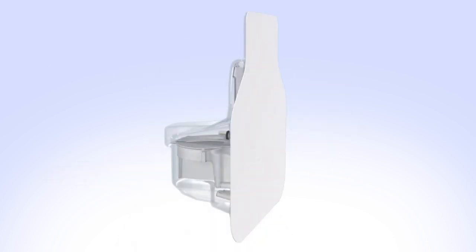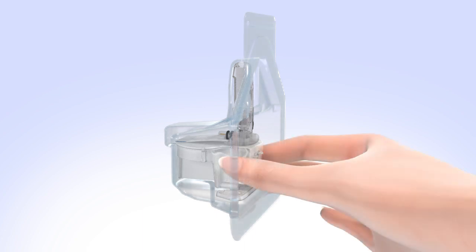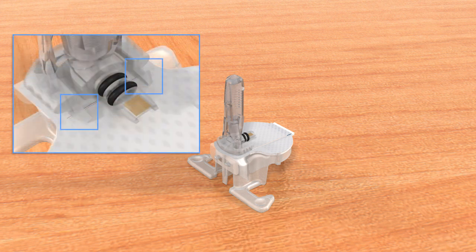Open the Guardian Sensor 3 package. Remove the sensor by holding the plastic pedestal. Do not hold it by the sensor or needle housing as this could damage the sensor. Place the sensor with its pedestal on a clean, flat surface, such as a table. Make sure the adhesive tab is tucked under the sensor connector and snaps.